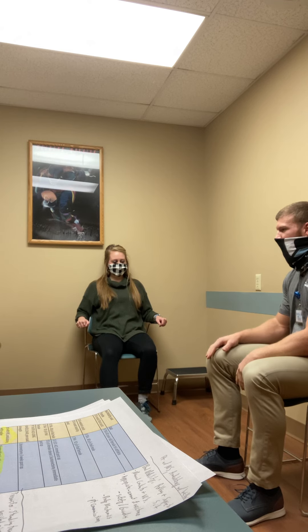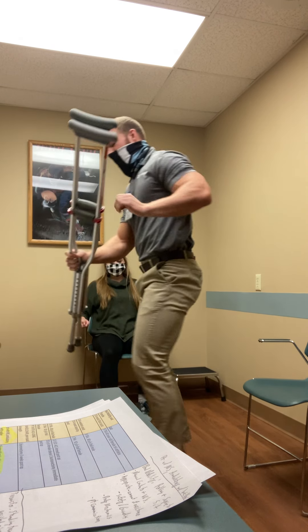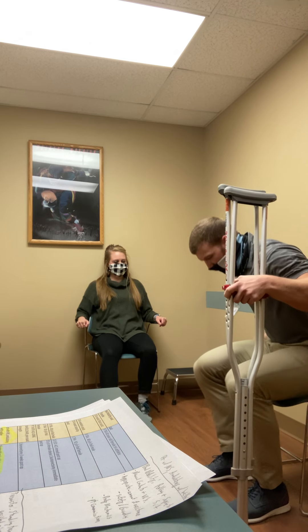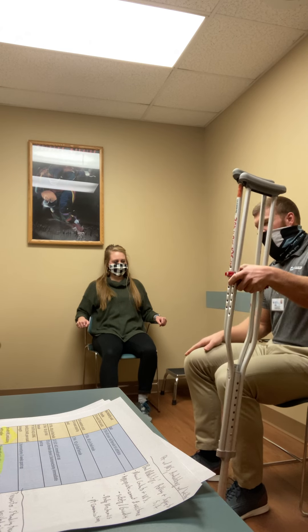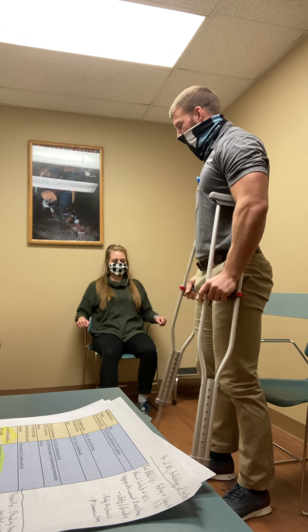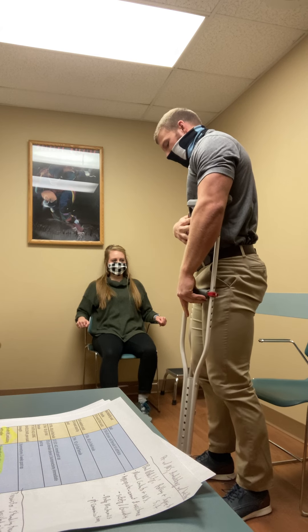I'm going to fit them to you perfectly and then show you how to properly walk with them as well. First, I want to show you how to properly stand up out of a chair when you have the crutches — scooting to the edge. Since the right leg is affected, the crutch is going to be on your left side, pushing off the armrest on the crutch and then bringing it over. I'm going to briefly go through it right now, but also go through it with you when you stand up and we adjust it to your height.